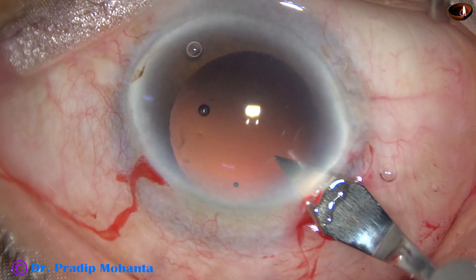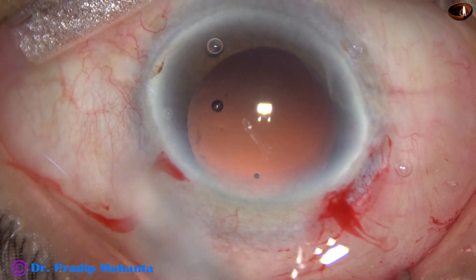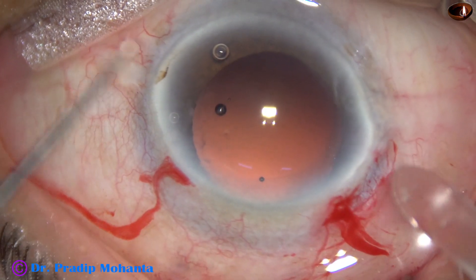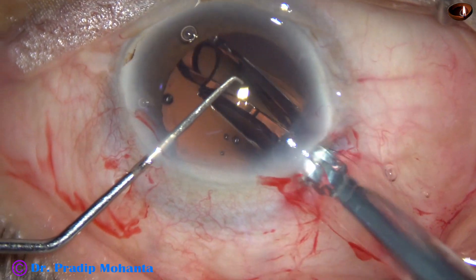And now the anterior chamber and capsular bag is filled up with 2% hydroxypropyl methylcellulose. The main wound is enlarged a little bit. And then a hydrophobic acrylic single-piece aspheric monofocal intraocular lens is implanted in the capsular bag.